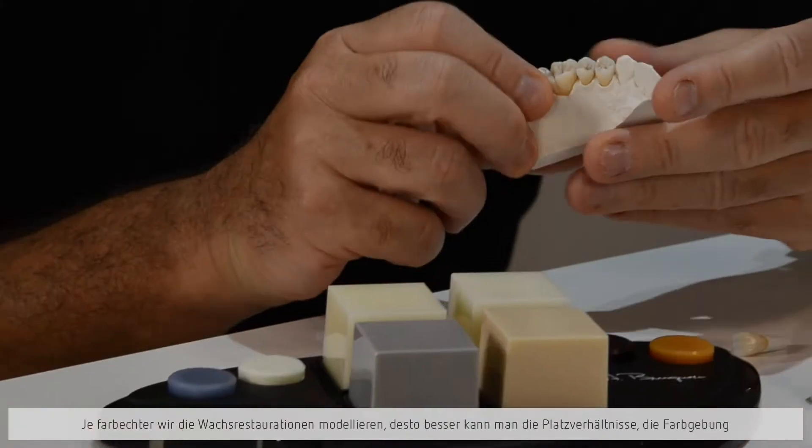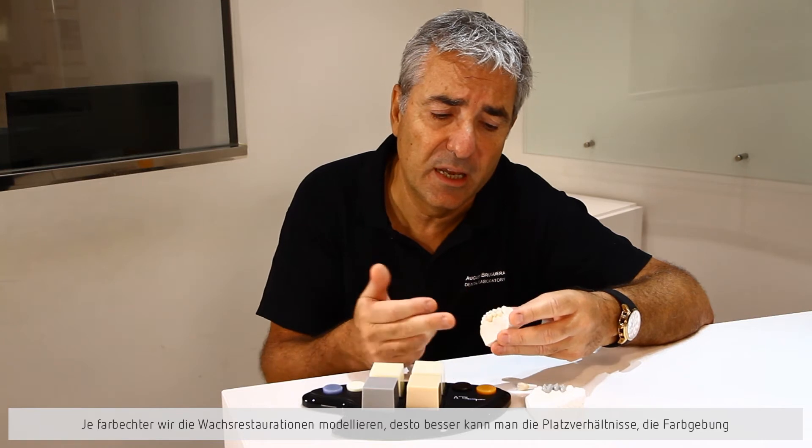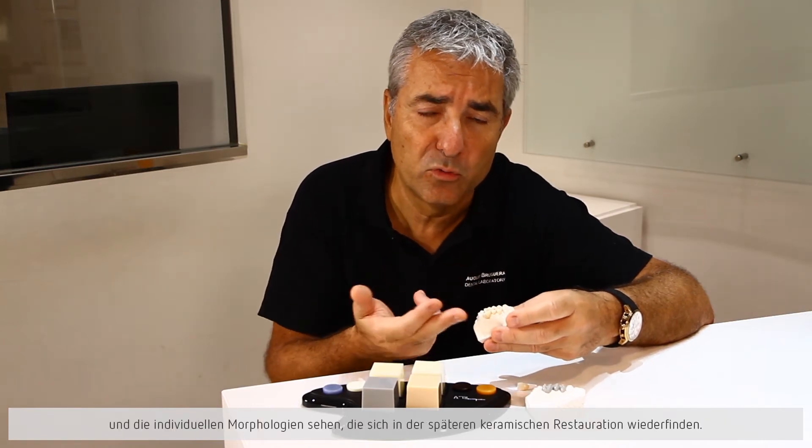When we work with different colors, when we create small areas of color and we work with a dentina and an incisal, we will see that our morphologies are much more realistic.